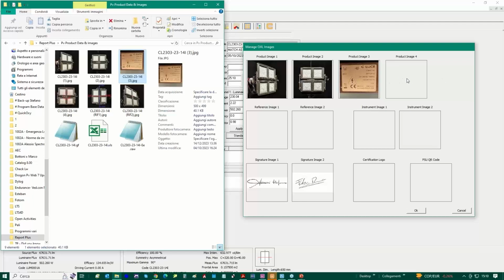So you can at any time go back and select the file. We are going to save the information. You load the file, and then in a single position, in a single file, you will have all the information you may need to understand if something was not good, to understand which lenses you used in your measurement.